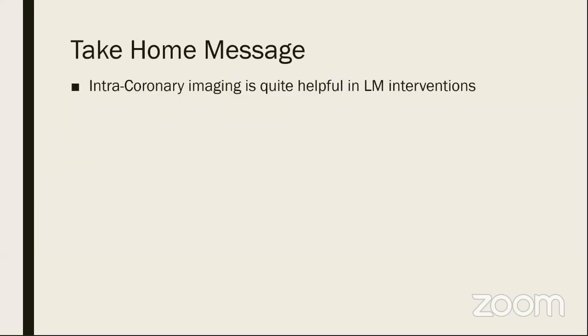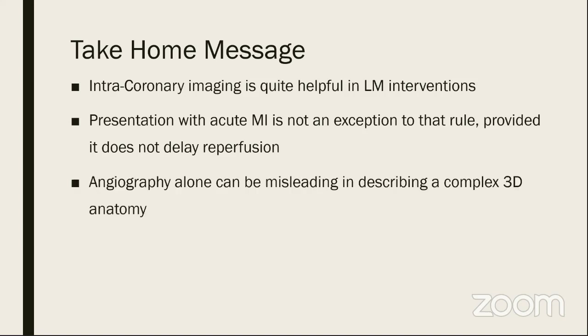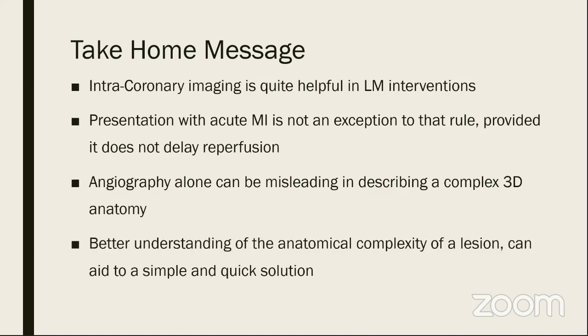The take-home message was that intracoronary imaging is quite helpful in left main interventions. Presentation with acute MI is not an exception to that rule, provided it does not delay reperfusion. Angiography alone can be very misleading in describing a complex 3D anatomy, and better understanding of the anatomical complexity of a lesion can aid to a simple and a quicker solution.